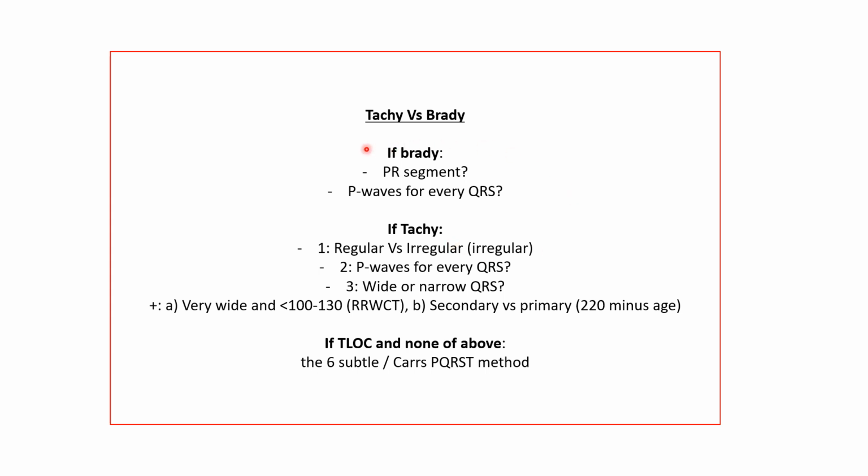And then if it's not obvious, and the patient presents with a transient loss of consciousness, then I'll go into looking at some of the subtle changes that we may see in ECGs, which we haven't talked about yet. That may be the cause of syncope in young patients especially, and they may lead to death.